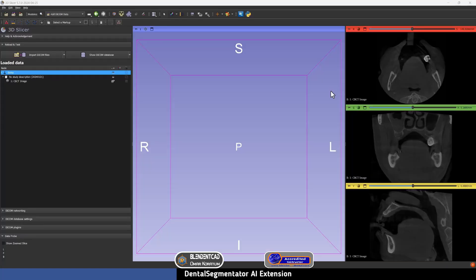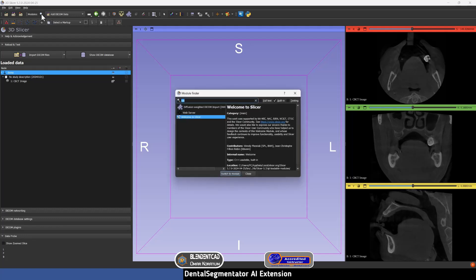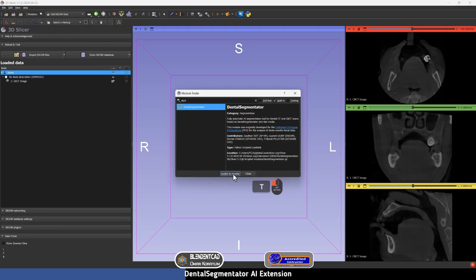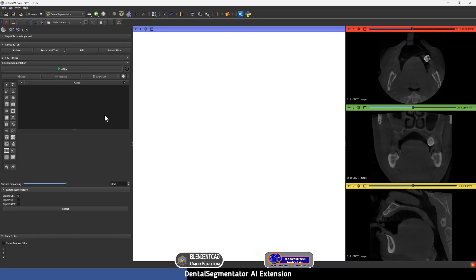After restarting the program and opening the patient's DICOM files, search for Dental Segmentator using the search icon, type Dental, and then Switch to Module. All you have to do is press Apply and it will perform the segmentation automatically. Of course, if this is your first time installing it, it will take longer to install the extensions and dependencies, but in the end it will segment the DICOM file. I'm going to press Apply and it will start segmentation on its own.